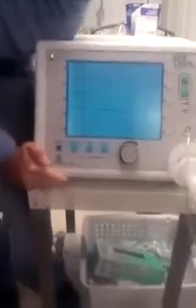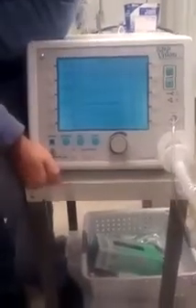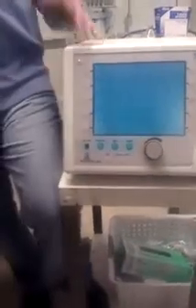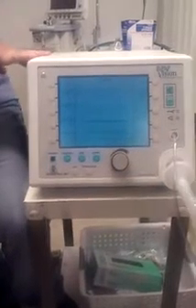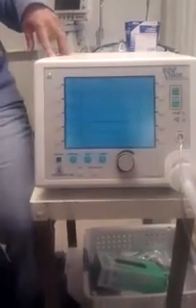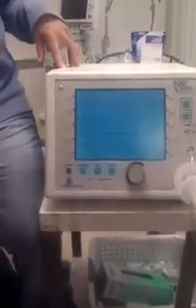You guys got about this? The rise time is the force that it goes in? Well, it's basically going on like a slope. Like if you look at it on the ventilator, you'll see a ramp and a rise time. I wish I could turn on one of these, or the A40 is probably easier. I prefer the ramp.